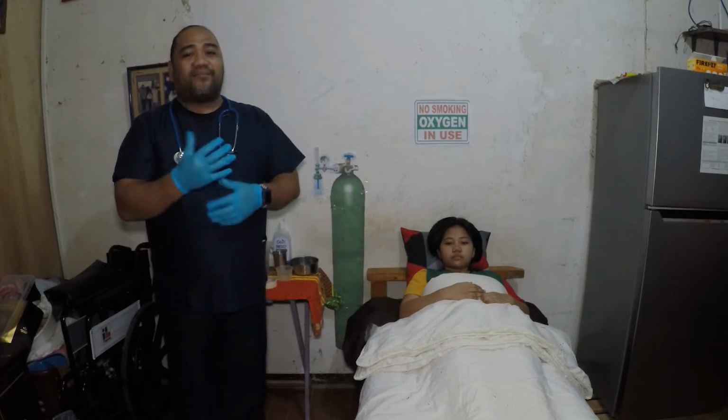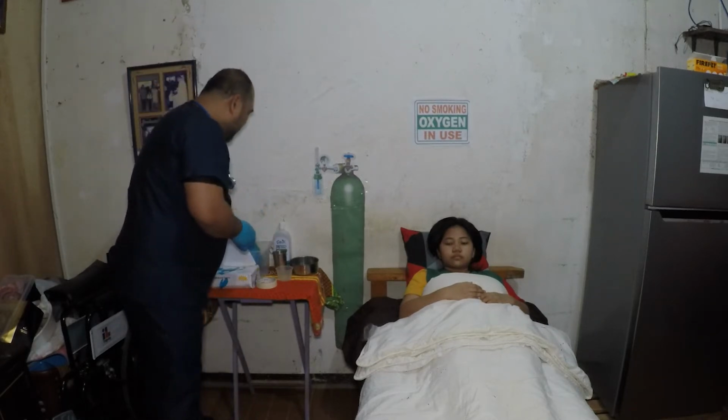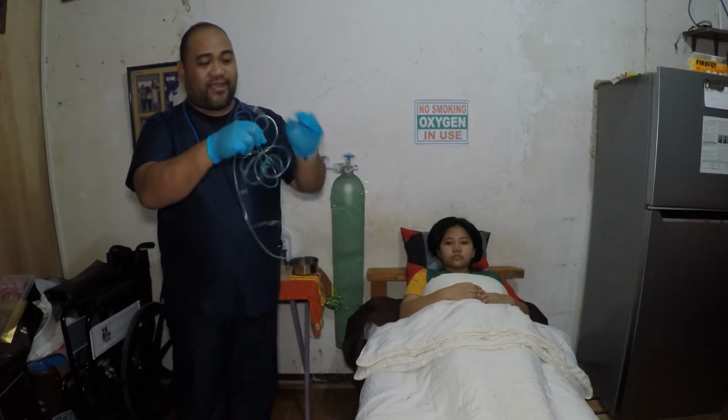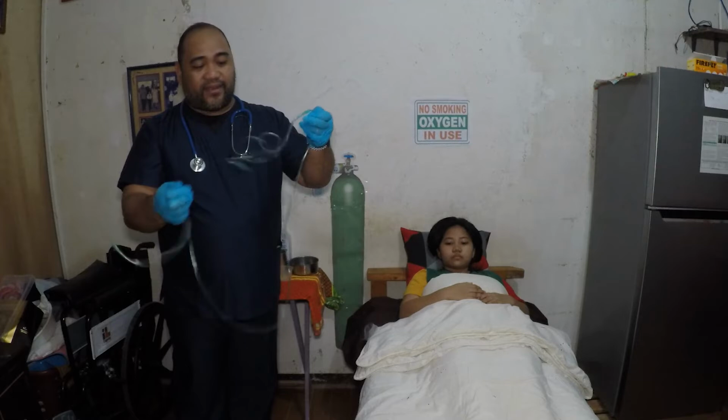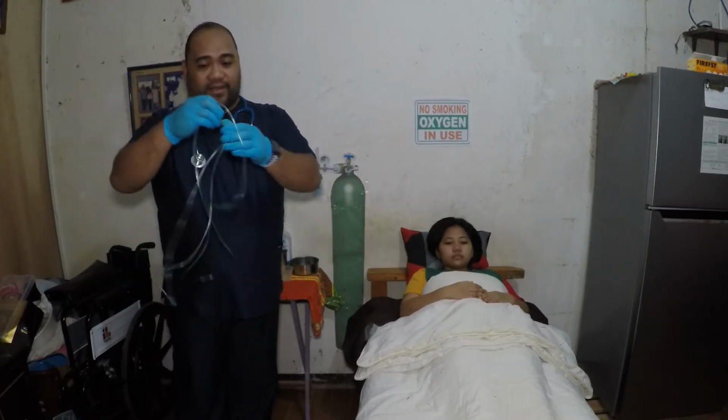And then blow out dust from the oxygen cylinder. Then attach the cannula connecting tubing to the adapter or humidifier. So this is the nasal cannula. Make sure this is really sterile or clean before we use it on our client.